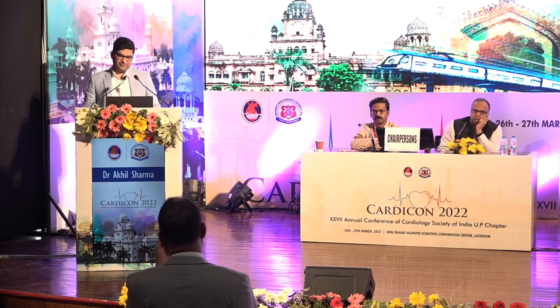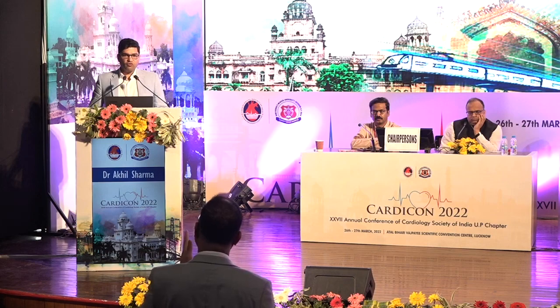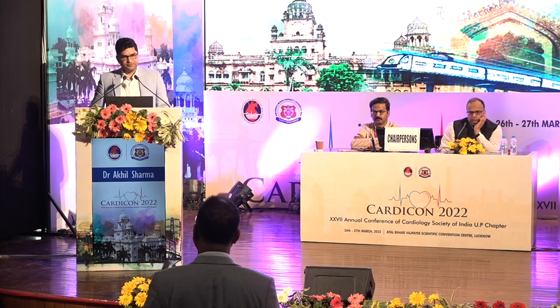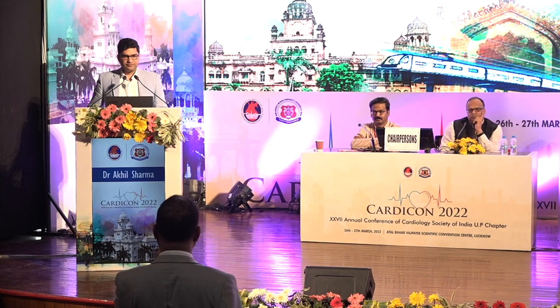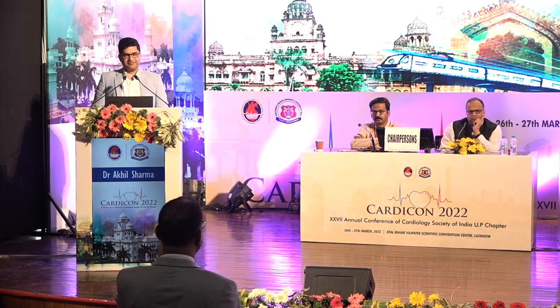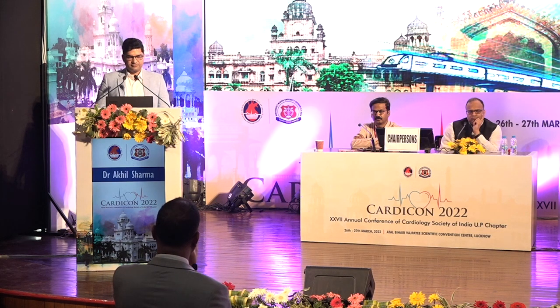Second, I might ask you a question. Which view do you take for pericardial drainage, AP view or lateral view? Which position do you think is the best? AP view, sir. Why? Since a lot of students are listening, the best view to do pericardial aspiration is lateral. Take a small dye in your 5cc syringe and keep tracking the dye until you reach the pericardium. AP view can never tell whether you enter RV or RA, but in the lateral view, behind the sternum there is the pericardium, there is a white space, there is fluid, then the epicardium comes. So go lateral. Thank you.